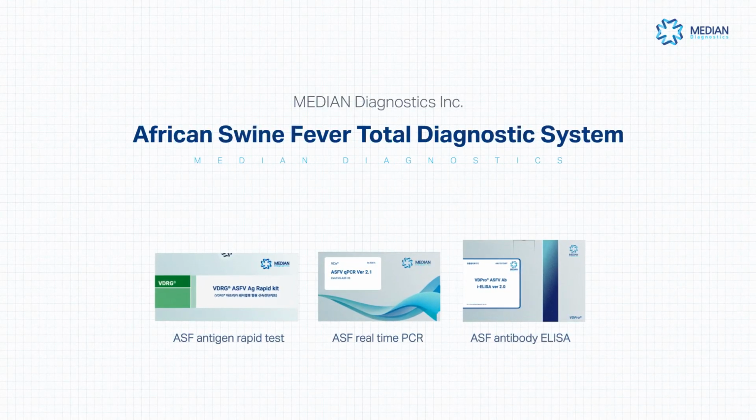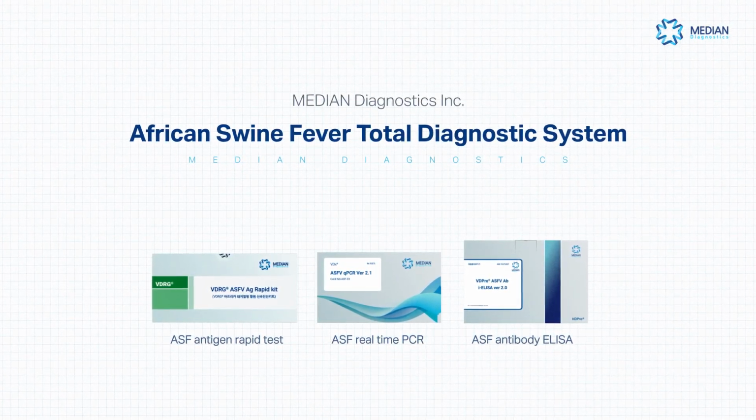Hello, this video introduces the African swine fever total diagnostic system.